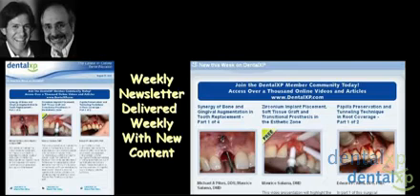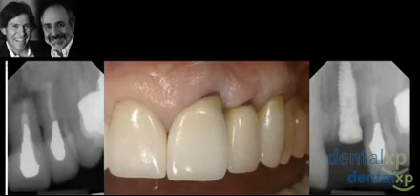So if we're going to go ahead and manage complications, let's start with a case such as this one. What we're really doing is really focusing on this problem right here in the maxillary right central incisor. It's a case that has been recently treated. The patient unfortunately has had some recession on the left central incisor and left lateral incisor, and we have an apical lesion endodontically that has been treated several times and is failing once again.